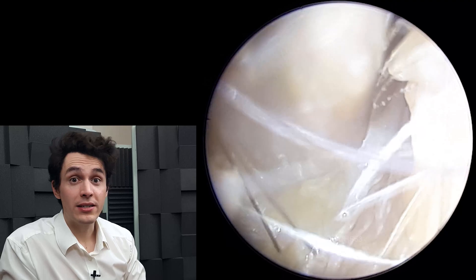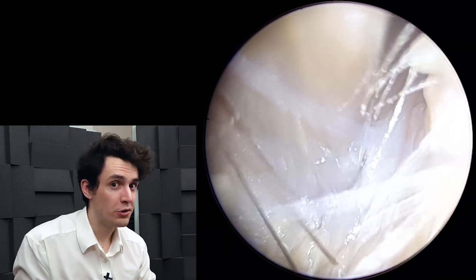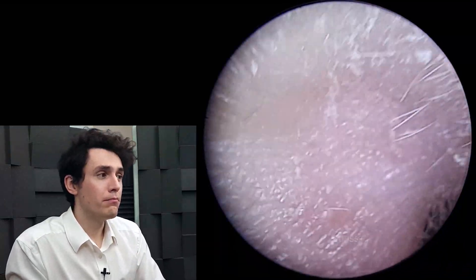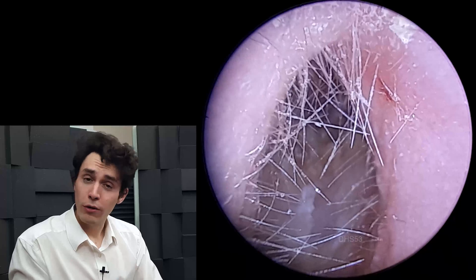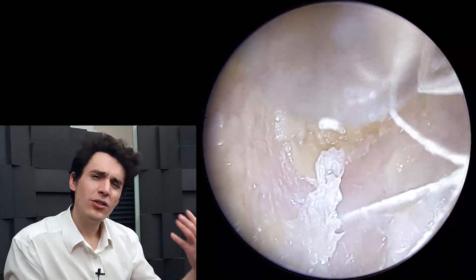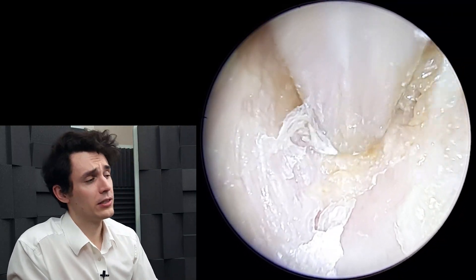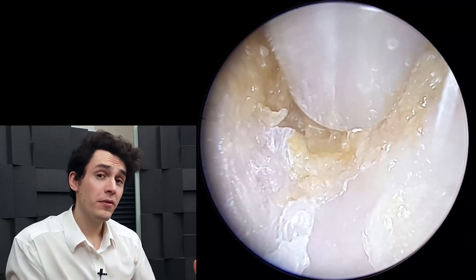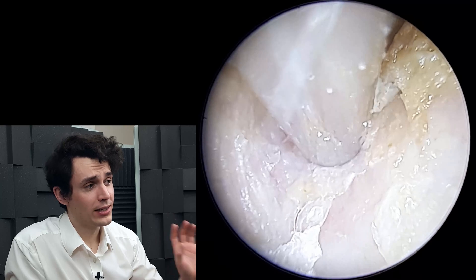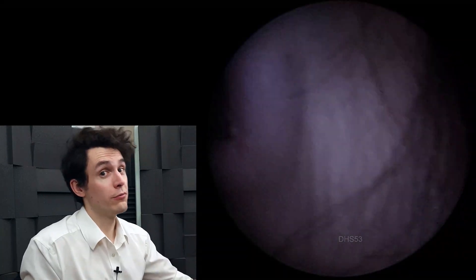Now, normally when somebody says that they've used any kind of drops that fizz — so sodium bicarb or hydrogen peroxide — my heart really does sink, because most of the time they've used a lot of it and it turns the wax into this sort of soup or slurry kind of slime consistency, which is very, very difficult to remove. And more often than not, there's a lot of slime kind of up against the eardrum adhered to it, which then results in the patient's hearing loss not being resolved.